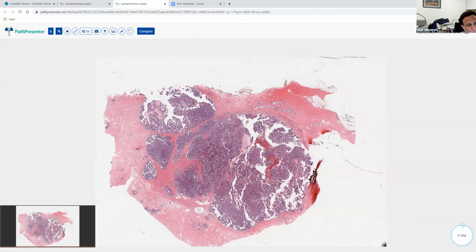But sometimes the problem will be that even here you may not see any, and this happens in encapsulated papillary carcinoma anyway. So if you don't have any myoepithelial layer here, then you don't have much of a ground to say that because I don't see any myoepithelial layer here, therefore it is invasion. So one has to make that determination of whether this is invasive or not morphologically. If you get lucky, a myoepithelial stain may help you objectify that, but it may not.